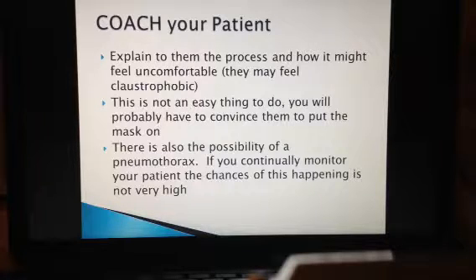Okay, and then next, before we talk about putting it on your patient, the CPAP machine, and applying it in the steps, we're going to talk about coaching your patient. You need to be their coach. You need to explain to them the process and how it might feel uncomfortable. You could see them become claustrophobic. They might not want to do it, but you need to basically persuade them that it's going to benefit them.